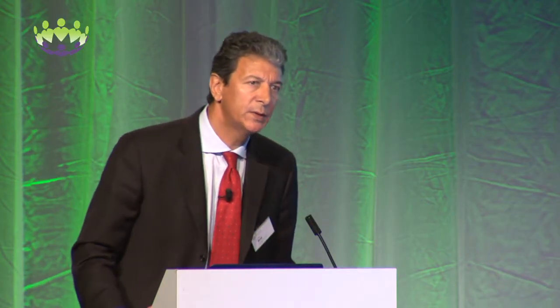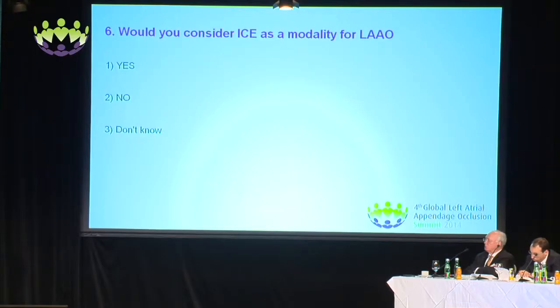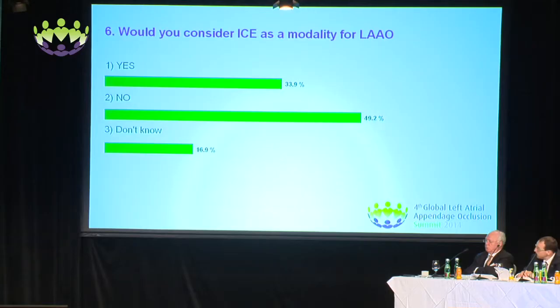The problem is if we think that the ICE can replace or could be a good alternative to the TEE in the guidance of the LAA occlusion procedure. Please vote. No, 49%. Yes, 33%.